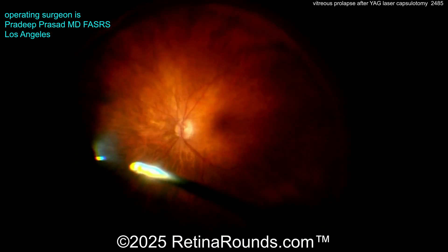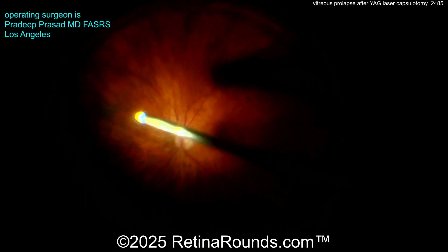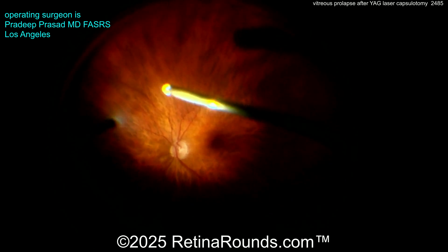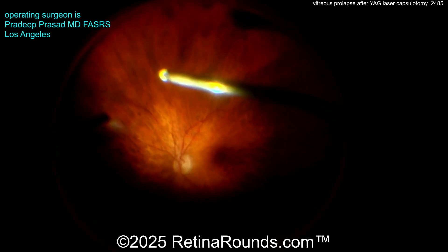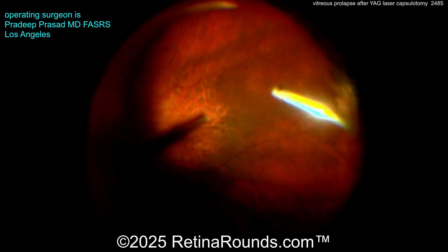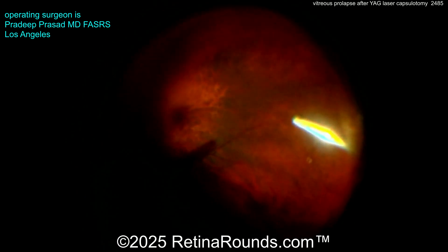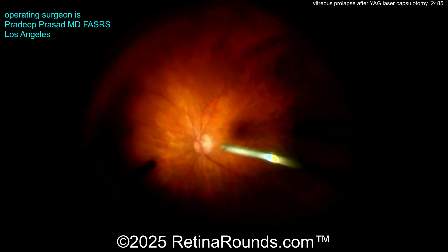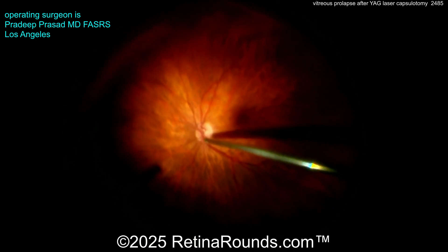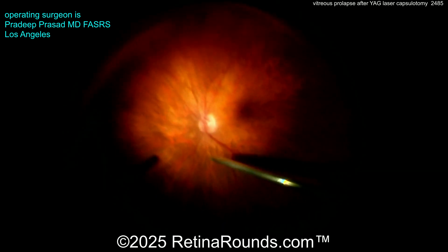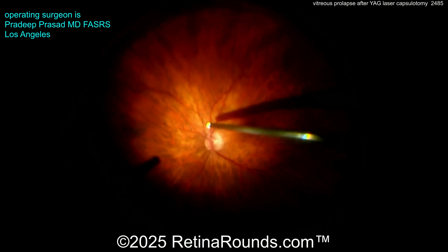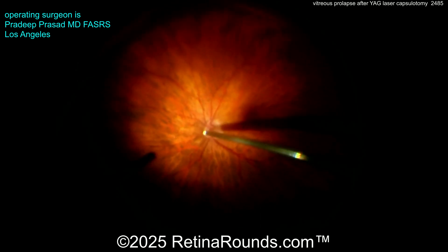You may be wondering: if this patient didn't have any capsule remnants, could just an anterior vitrectomy be done? There's really a lot of benefit to doing a complete pars plana vitrectomy. First, you're going to really decrease the likelihood that additional vitreous will migrate into the anterior chamber later on. Second, doing a thorough vitrectomy is going to decrease the risk of a retinal tear or detachment long term.